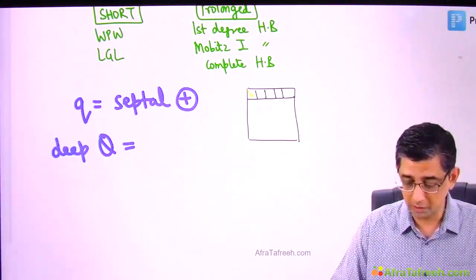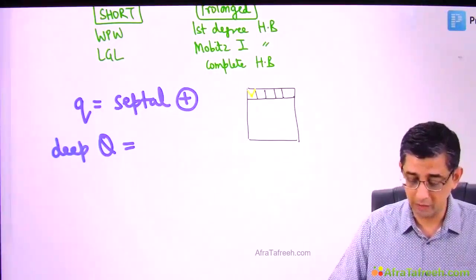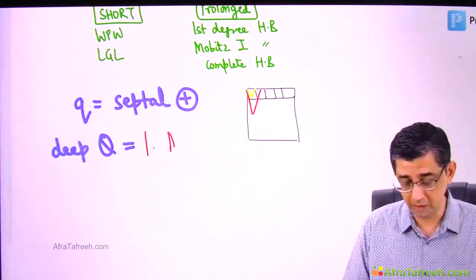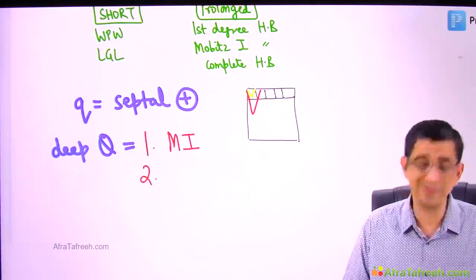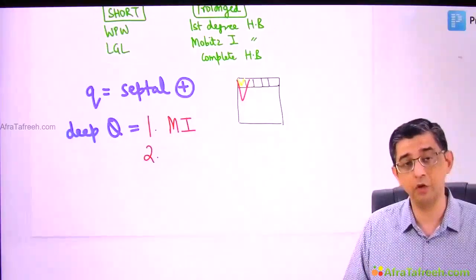Now I'm going to draw a Q wave in slight yellow color. It fits into one small square. Now I draw an abnormal one which is spilling out of it. The first condition having this is myocardial infarction. In fact, a deep Q wave in MI signifies cell death, and this finding will persist for the whole life of the patient. It's never going to go back.